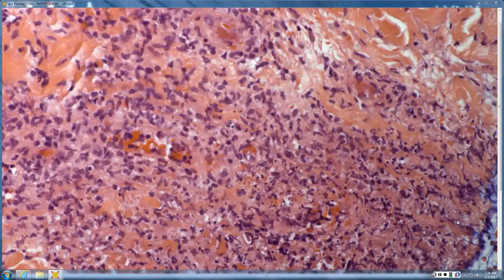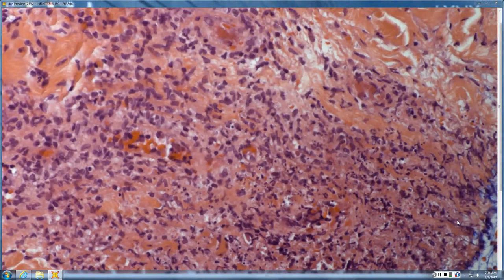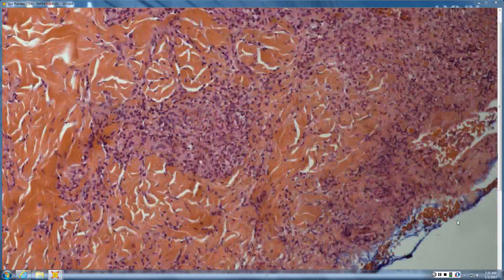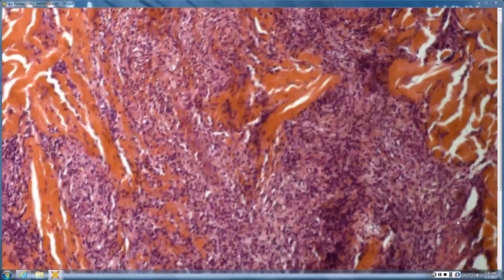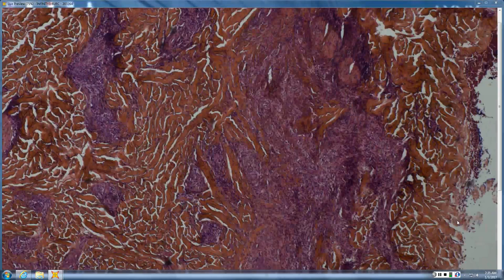But there's more, there's neutrophils. Yeah, so this is neutrophilic, which is less... Never mind. Which is less lupus-y. Right. And you have lots of thrombi and vessels. So, you have definitely a vasculitis going on in addition to the folliculitis. Like folliculitis decalvans? Folliculitis decalvans is certainly a suppurative folliculitis. Doesn't usually give you vasculitis with it, though. I mean, this has a rip-roaring vasculitis.